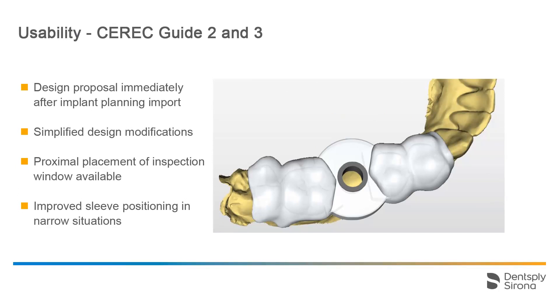Next, we will briefly look at the latest features regarding the CEREC Guide 2 and 3 design. CEREC Software 5.2 provides a guide design proposal immediately after importing the implant planning data into the CEREC software. Given that sufficient dental structure was scanned, two distal and mesial adjacent teeth will be included.